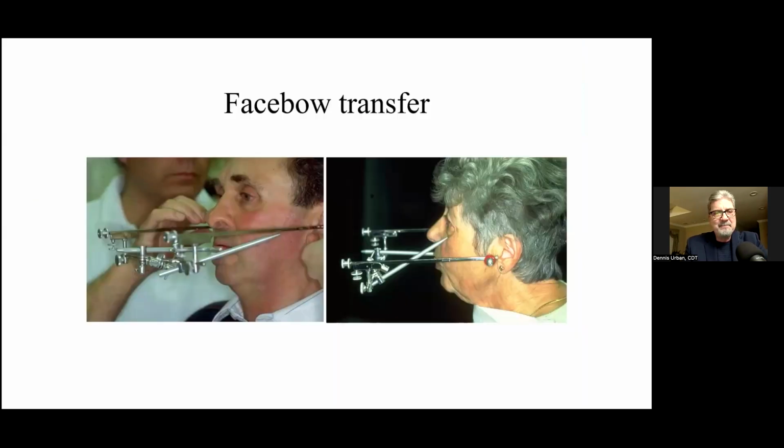And then you have your facebow transfer. Every time I do a lecture, I have a room full of doctors. I talk about facebow transfers, and I see doctors cringing. So I like a facebow transfer when we're doing a fully adjustable, full mouth reconstruction.